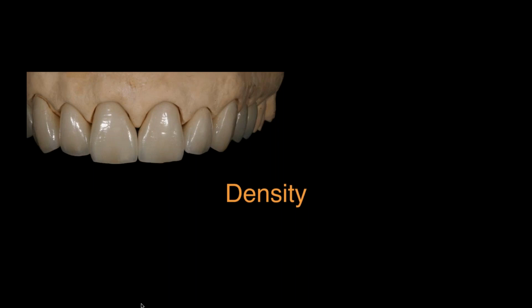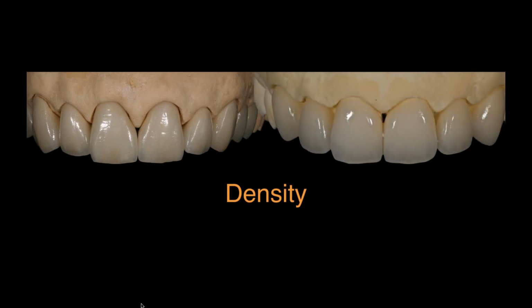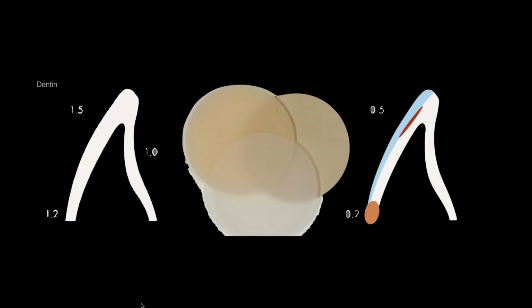For younger teeth, I tend to want more opacity but brighter on the inside and slowly get more and more translucent. For older teeth, I want that same opacity inside, but I don't want it to get translucent so quick. I want to slow down the translucent process, because I don't want the light getting all the way inside the tooth like I would with younger teeth. I want to kind of keep, let's say, a deader look or a more densified look of the tooth structure. So it's really no different in the buildup. It's just switching around the powder systems that I'm using.